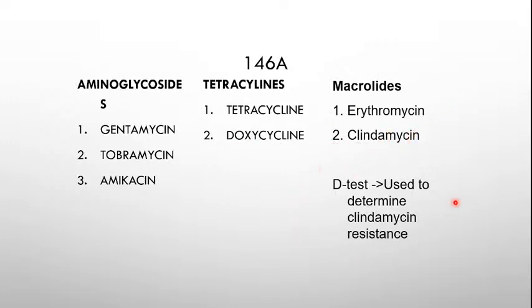Now, the reason why I discussed this is because you need to use D-test to determine clindamycin resistance. Okay? D-test. So, what is D-test ba? I'll show you what D-test is. I think sinerch ko na siya kanina. Ba't nawala yung tab? D-test. Okay. I think I searched it earlier.